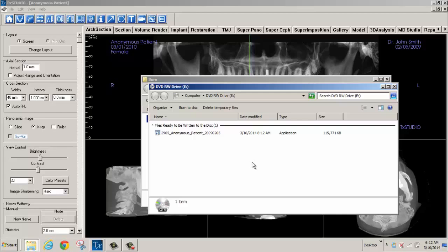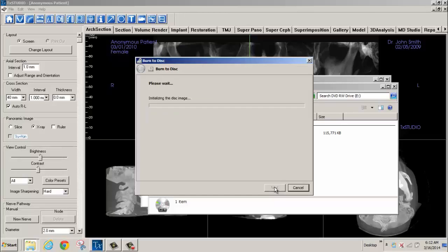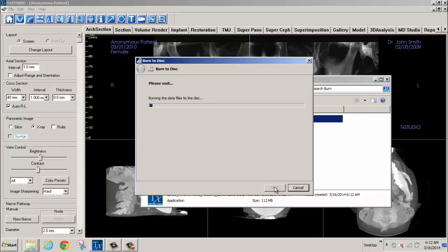The DVD RW Drive pop-up window will appear next. Select Burn to Disk. The Burn to Disk pop-up window will appear. Make changes or accept the defaults by clicking Next.